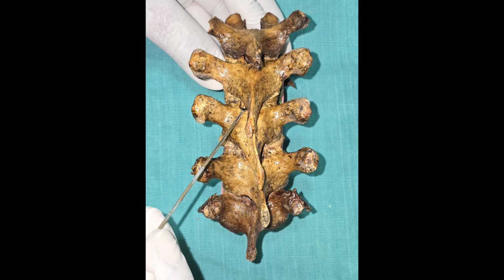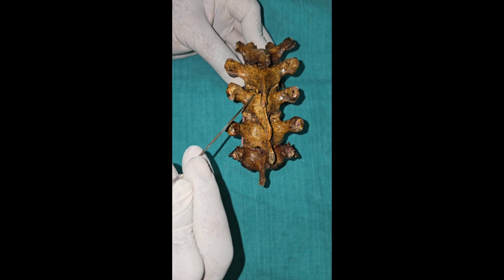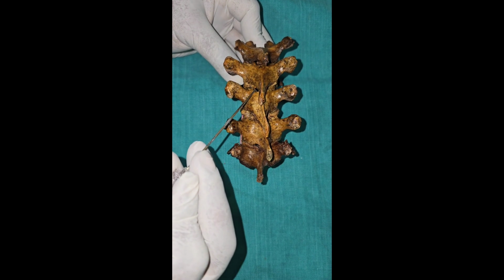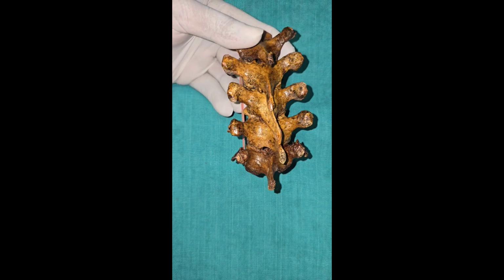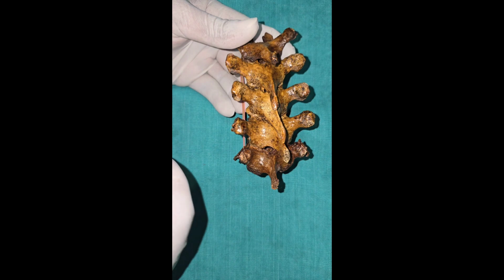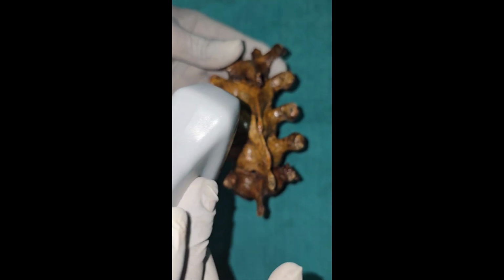But how we do it in real time is the needle entry is in this manner. What you need to know is the spinous process of each vertebra, and then the needle lands on the lamina of the lower vertebra, and further the needle lands on the transverse process of the further lower vertebra. This is the zone anatomy you need to know. This is how the needle goes from lateral to medial. It hits the upper summit of the lower vertebra and enters into the T4, T5 space.